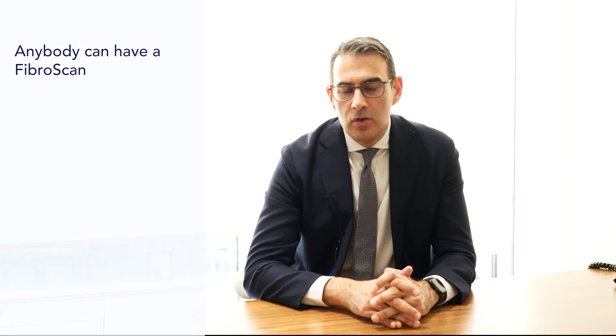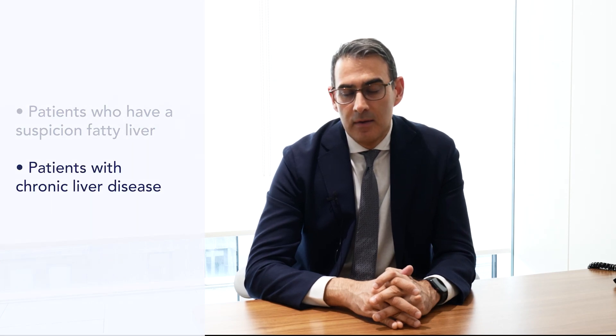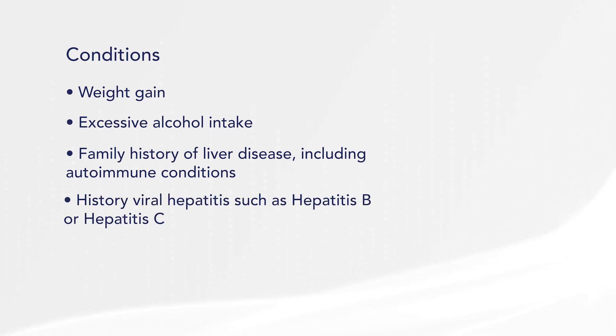Essentially anybody who has liver disease or the suspicion of liver disease needs a FibroScan. It allows us to quantify if there's any scarring in the liver, which is the consequence of chronic liver disease, and also to quantify how fatty the liver is. Conditions such as weight gain leading to fatty liver disease, excess alcohol intake, a family history of liver disease including autoimmune conditions, a history of viral hepatitis such as hepatitis B or C, or metabolic conditions such as excess iron in the body — hemochromatosis — or excess copper in the body — Wilson's disease — all need to be screened, and the FibroScan is a very good non-invasive tool to measure that.